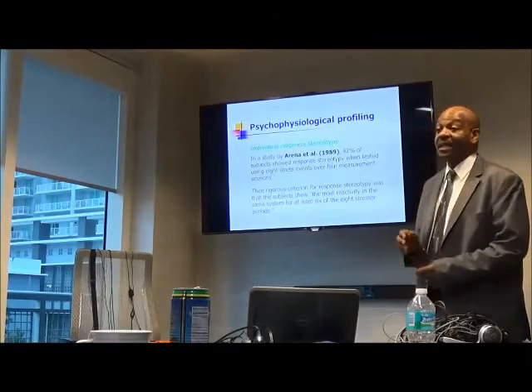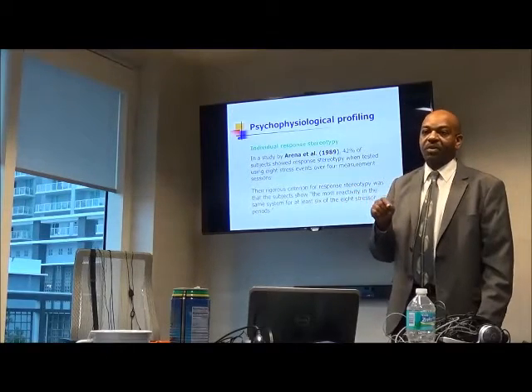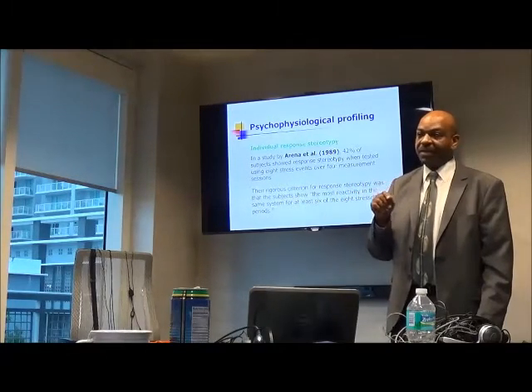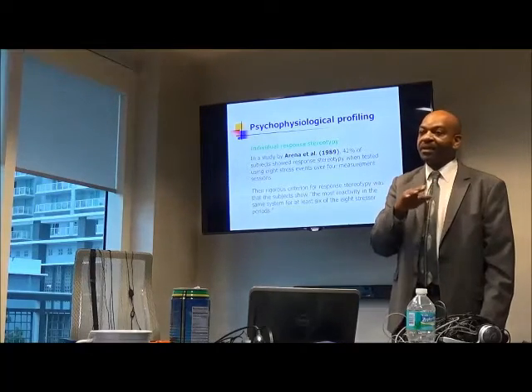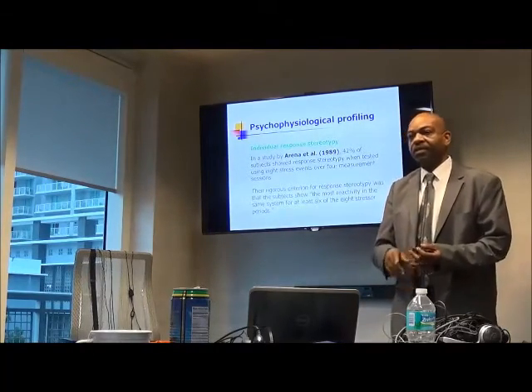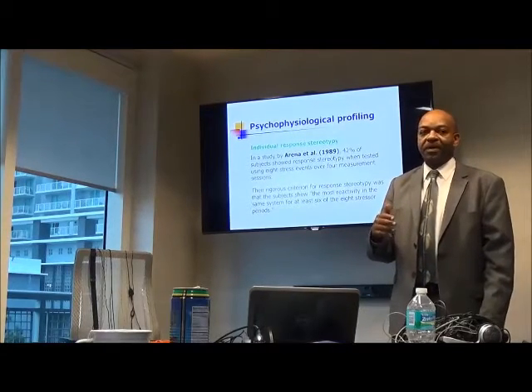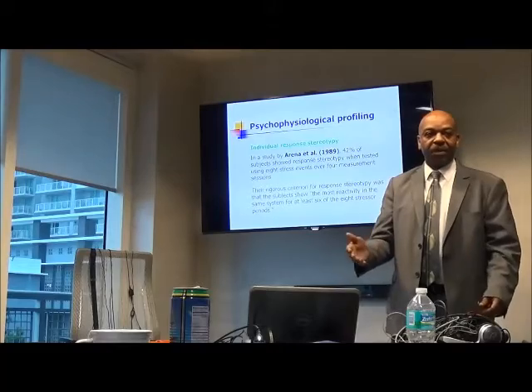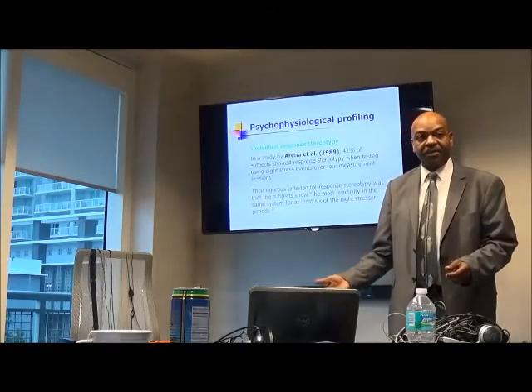And what I see a lot when I'm doing the stress assessments is that when the person talks about a stressful event that was real for them, the response is much greater than it is for the Stroop test or the math test, because some people are very worried about performing in front of somebody, so the math or the Stroop would be very stressful for them.